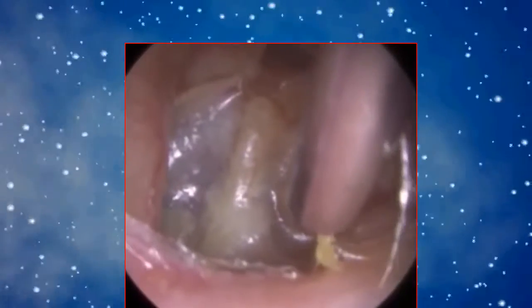I've got a feeling my narration is going to roll over. So I'm just going to go back to the ear in a moment and I'll explain the mastoid. So in front of us now, that's the eardrum. You can just see the hammer bone in the middle. Obviously, there's a lot of surgery, so it's not your normal appearance. You can see all I'm doing is moving skin, and I'll come back to why we're doing that, why it's important, in a moment.